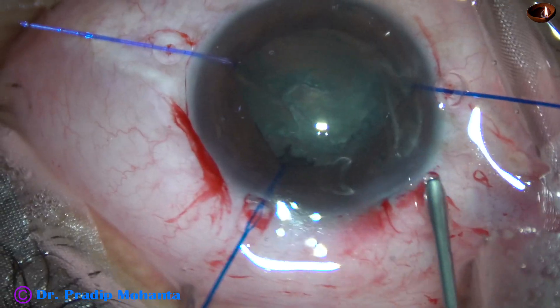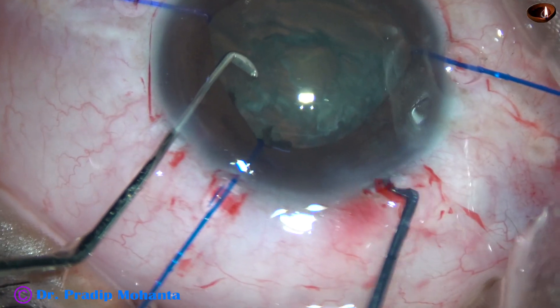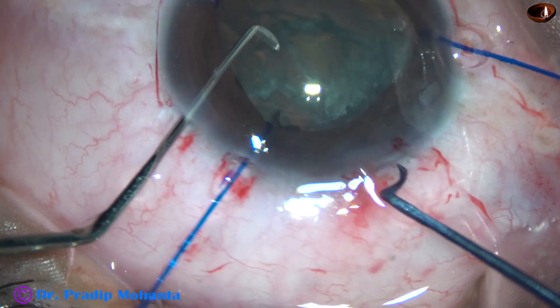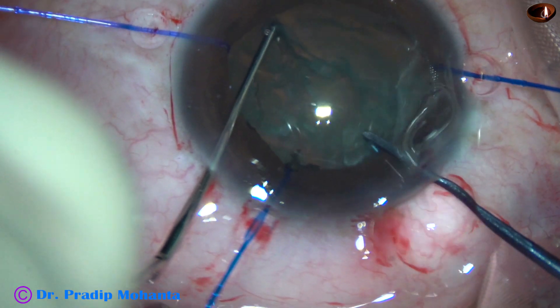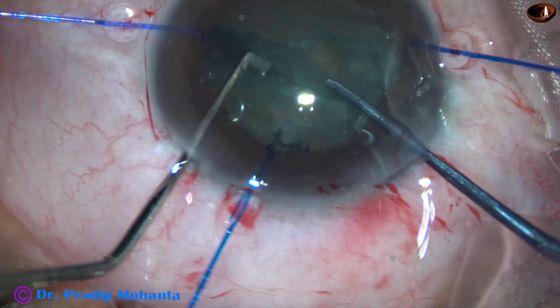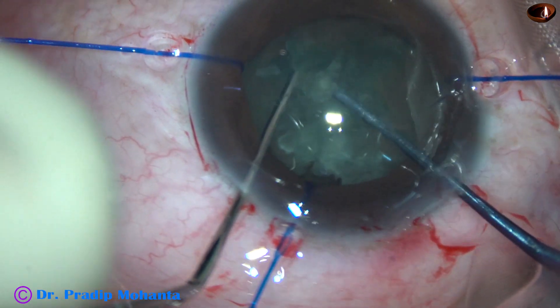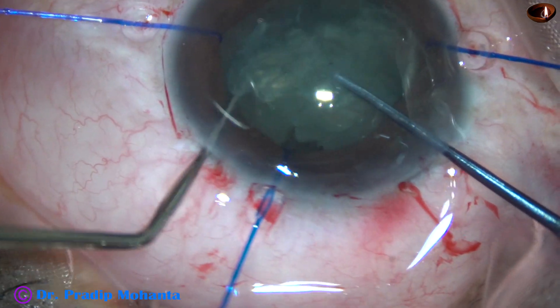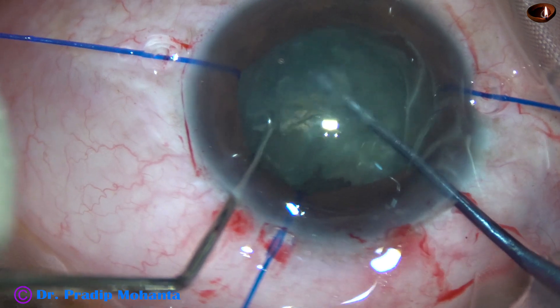I fill up the anterior chamber again with 2% HPMC. Now I am going to use Dr. Sohel's pre-chopper for dividing this lens mass into fragments. It divides nicely into two pieces. I divide one hemi-nucleus, rotate, come to the other hemi-nucleus, and divide it as well.